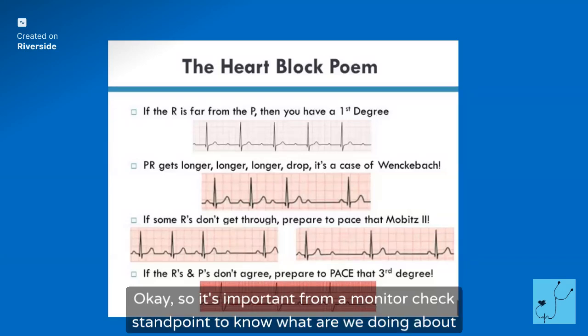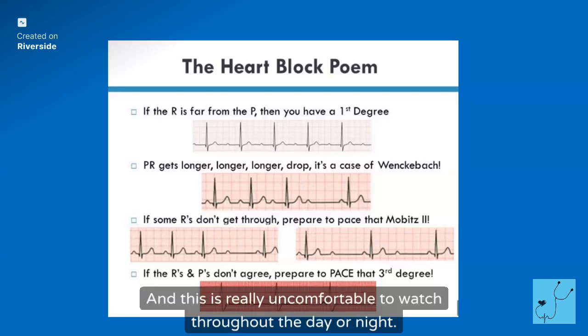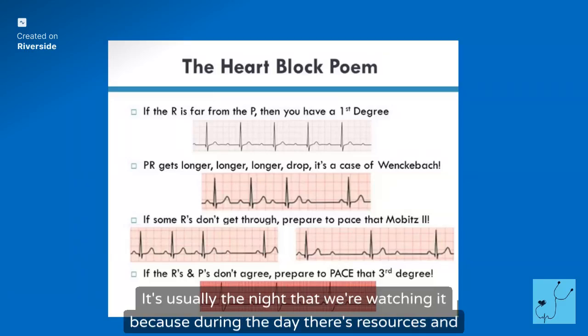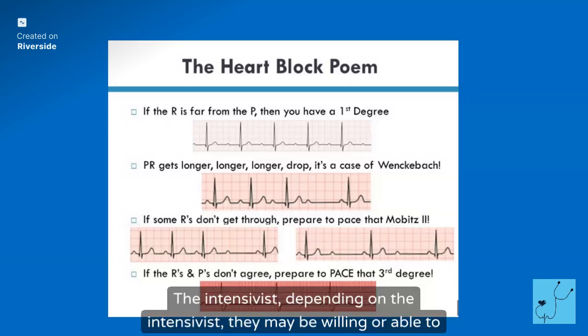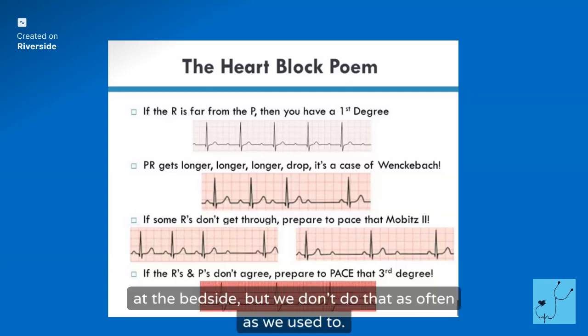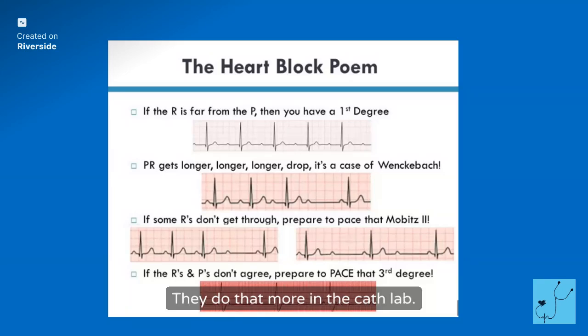Okay, so it's important from a monitor check standpoint to know what are we doing about this, and this is really uncomfortable to watch throughout the day or night. It's usually the night that we're watching it, because during the day there's resources and doctors here that could actually put in the pacemaker. Depending on the intensivist, they may be willing or able to put in a transvenous at the bedside. But we don't do that as often as we used to. They do that more in the cath lab. So it just kind of depends.